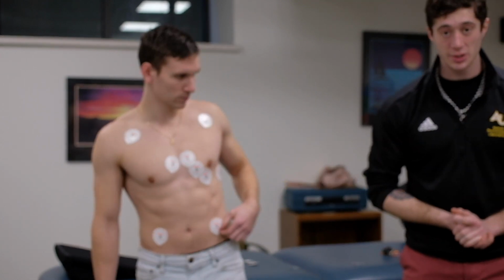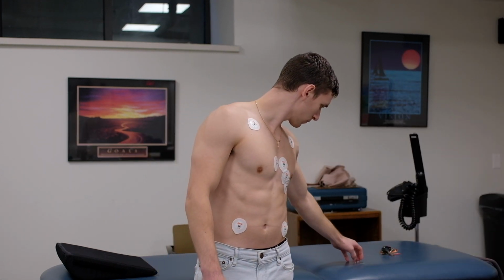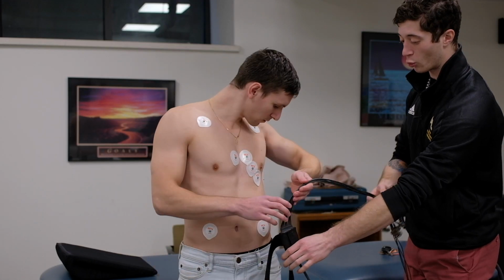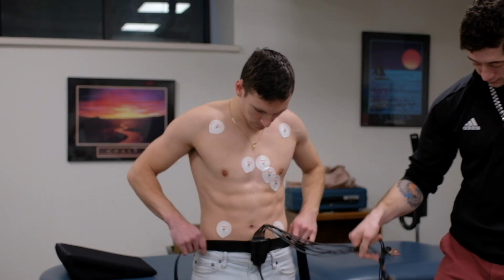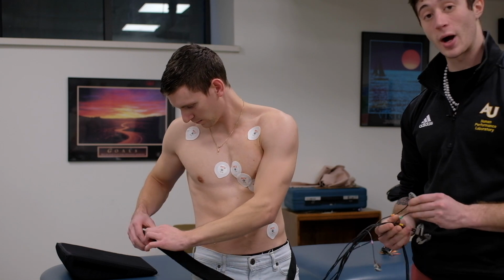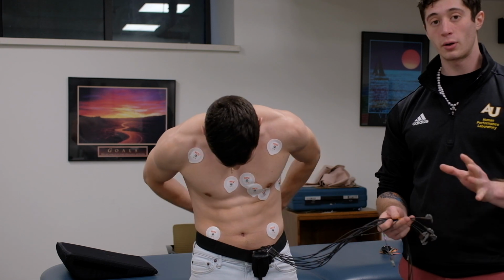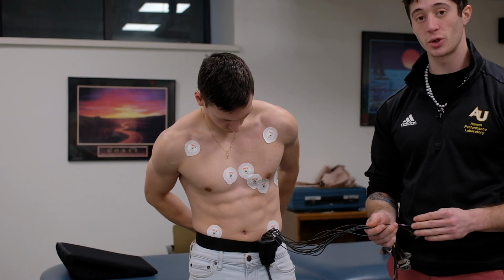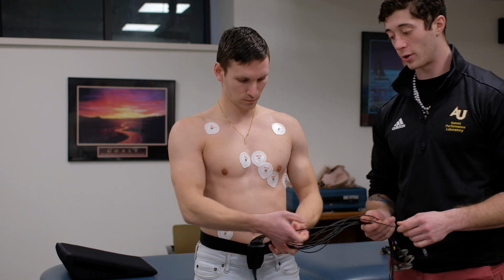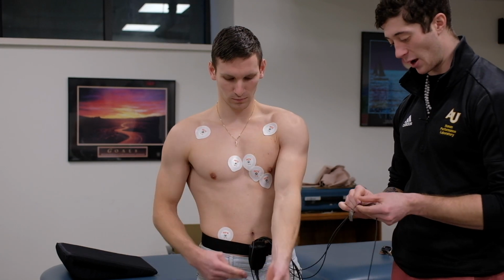Once we've applied all the leads, we can then go ahead and attach the wires to the leads. So we'll bring the belt over here. We'll instruct Peter to wrap the belt around his waist and secure it with the wires in front. All of these wires are labeled, and so they're very easy to put on. The one caution that I have for you is make sure you do not mix up the right and left side, otherwise your data will come out very weird. So we'll go through the application of these now.